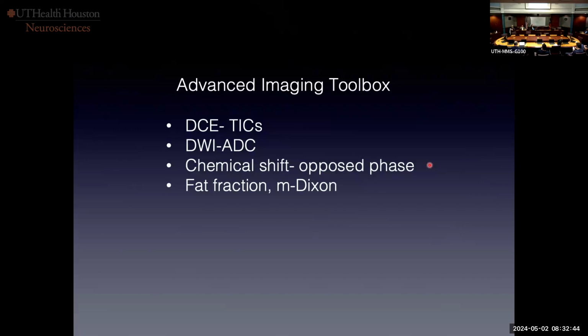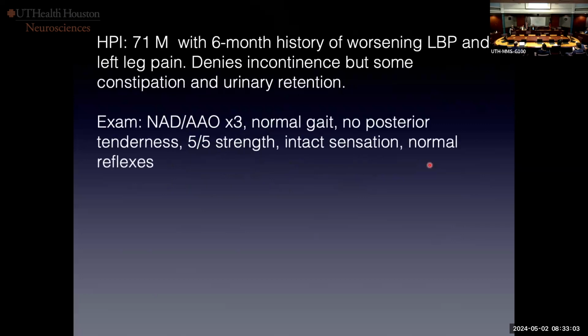If you don't see signal drop, then that suggests that there's not enough fat in that lesion to drop the signal. So I think that's one of the more interesting ways that people look at these lesions. They're basically microscopically looking for fat. Yeah, we don't do that. I think MSK sometimes does that for some of their lesions, but you're right, it functions well in the literature.